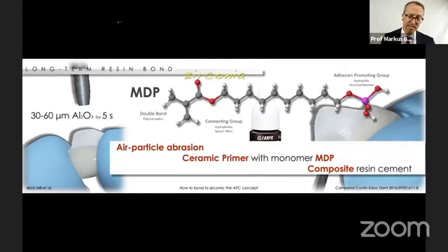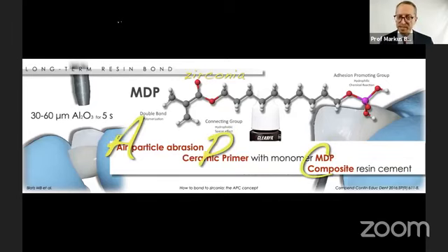In these cases, where you rely on bonding, I always found it difficult that people keep it in their mind. This is why I made an acronym for this technique: air abrasion, primer and composite, and we call it the APC technique. This is nothing new. It's just summarizing our research over the last 20 years.